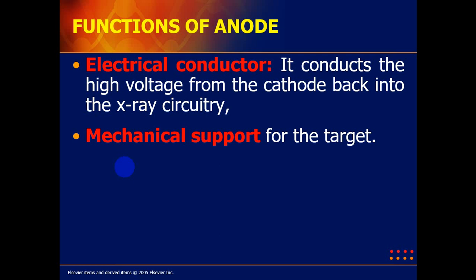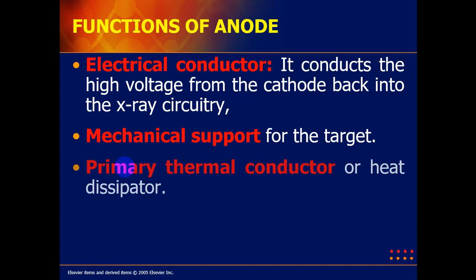Kasi etong target, dito mismo mag-bombard ang electrons from the filament papunta sa target. So, ang anode mismo ang hahawak sa target. And primary thermal conductor or heat dissipator.